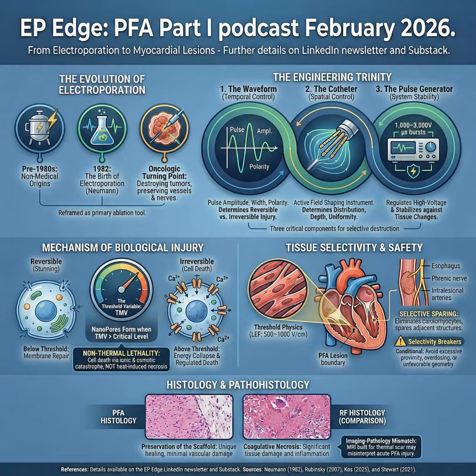Okay, let's start where PFA actually starts, not in the EP lab, but at the level of membrane physics. So, electroporation. The simplest way to picture it is this. Cells have membranes, and that membrane behaves electrically like a capacitor. If you apply a strong enough electric field across it, even for a very short time, you can destabilize the lipid bilayer and create pores. Those pores change permeability. Ions move, water shifts, the cell's carefully maintained gradients start to collapse.